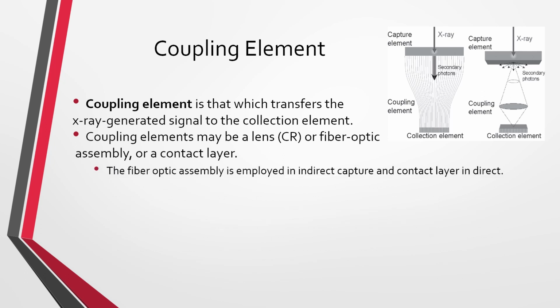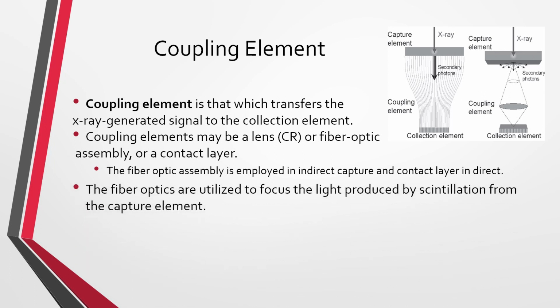The fiber optic assembly is employed in indirect capture, and typically a contact layer could be considered the coupling element in direct radiology. The fiber optics are utilized to focus the light produced by scintillation from the capture element, as we said.